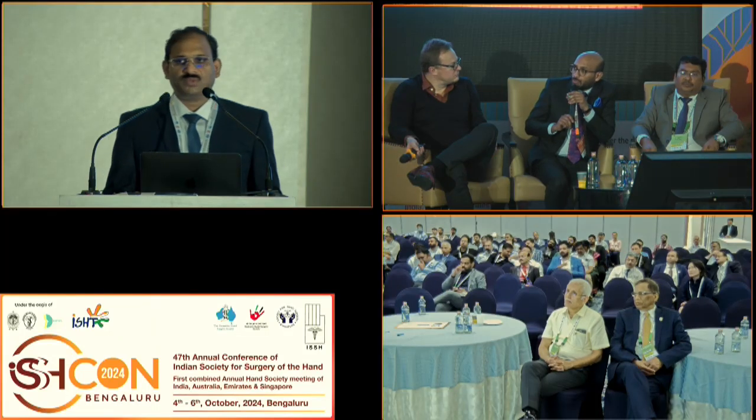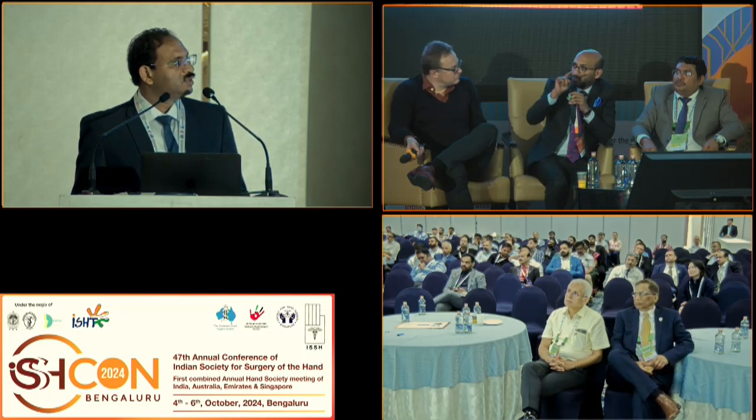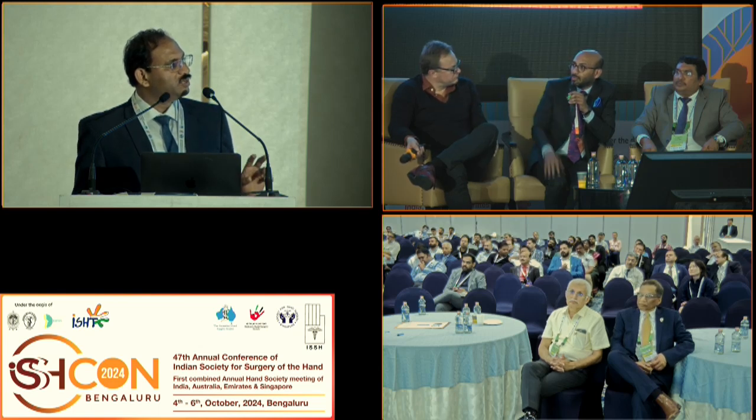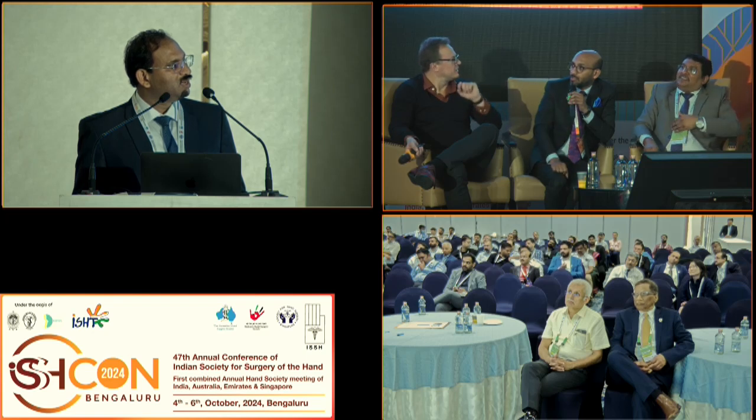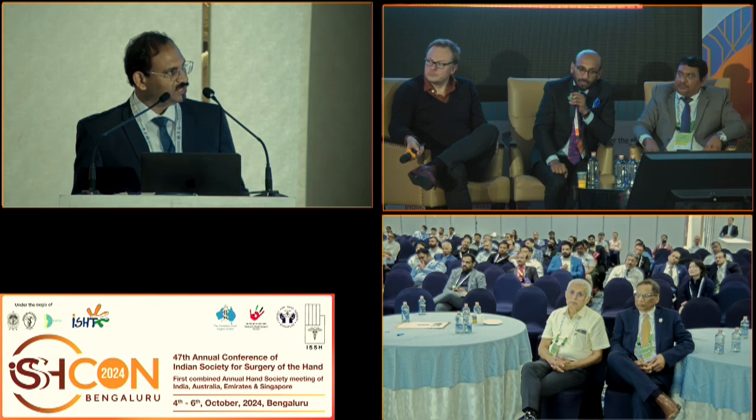How many portals do you use, Amit? Because we see you're seeing through the scope, you're impacting bone and also using another impactor at the same time. Means you have 2 portals, midcarpal radial, midcarpal ulnar. But you insert the bone graft and the impactor also through one more adjacent portal? Same through the same portal you're using? Yeah, same portal. Okay.